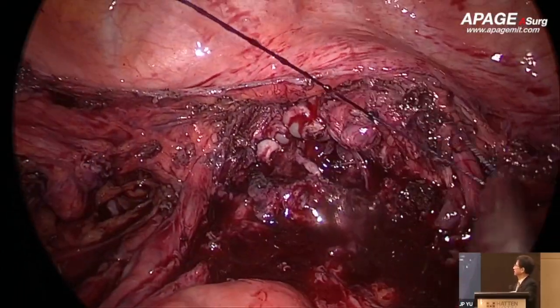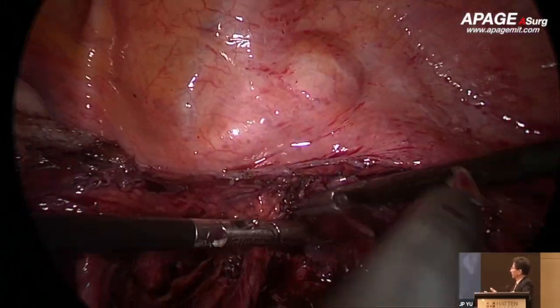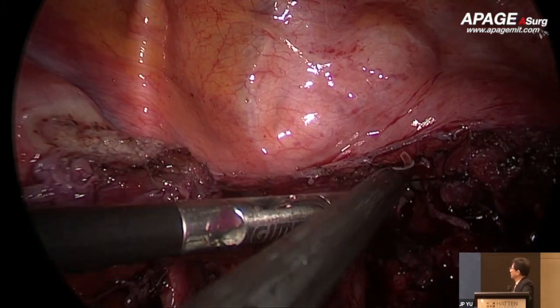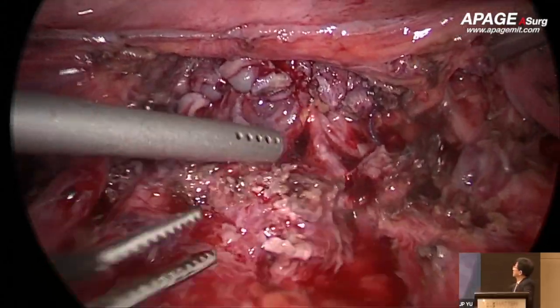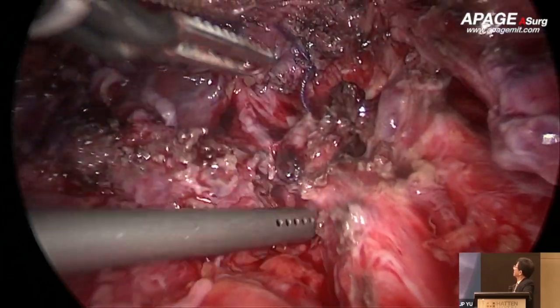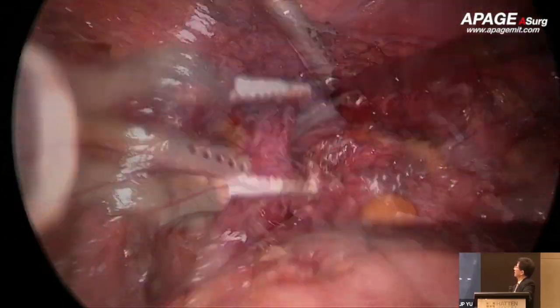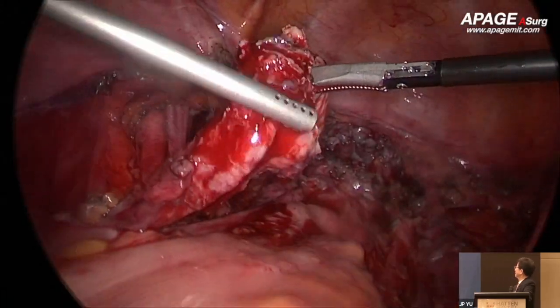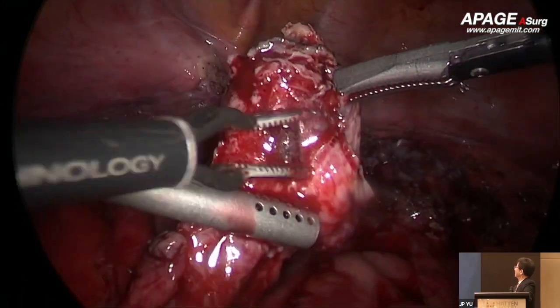For patients with deep endometriosis after the radical surgery, we always just keep observation. We don't give them adjuvant therapy after the surgery. So that's the reason. Yes. So we can find after the surgery, they do not have any other surgery choices, so they can also get enough tissues. And that is the ovary.